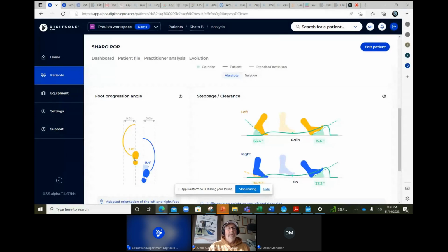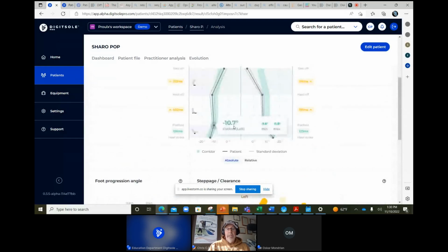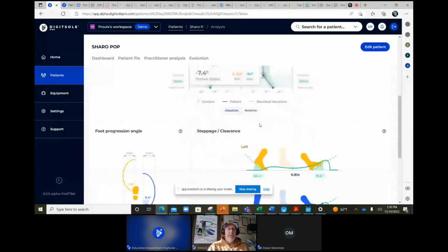What's interesting is that as you increase that toe out position too much, it actually affects your heel strike pattern. You may still heel strike with the typical supination, but just because of mechanics, you're going to quickly go into a more pronated position. Let's look back up here for a second. That's exactly what we see here. Negative 14.9, but she transitions quite a bit and does start to find a trajectory of going into that heel eversion and pronated foot position.